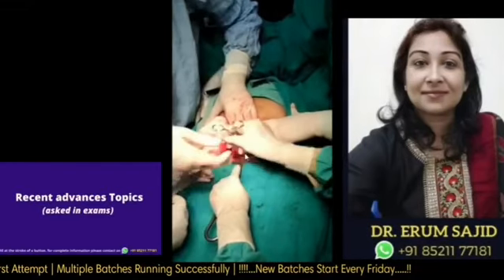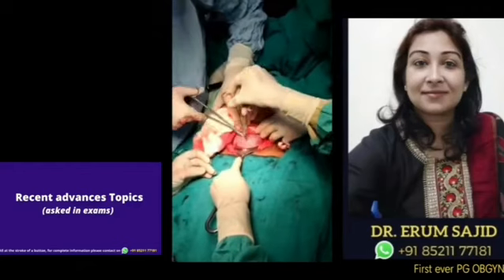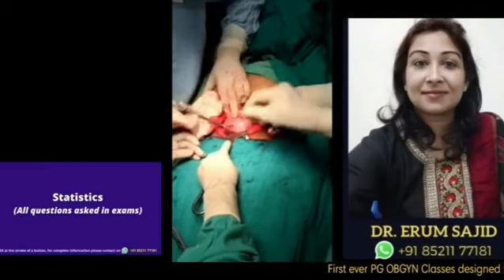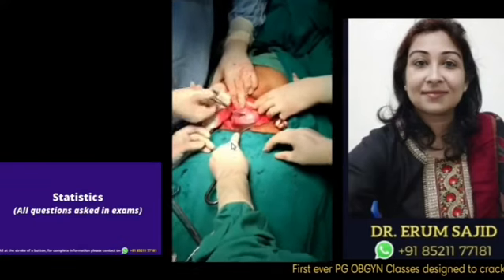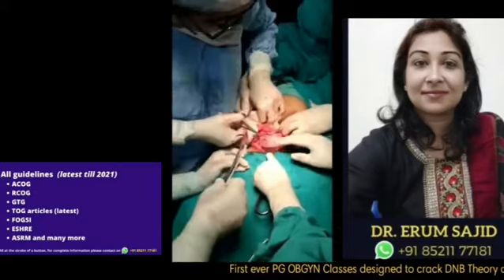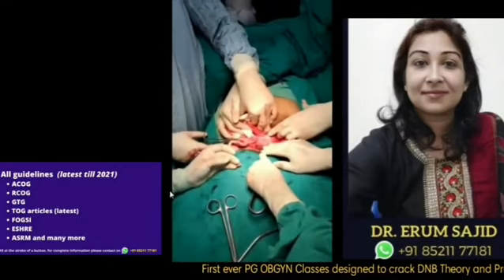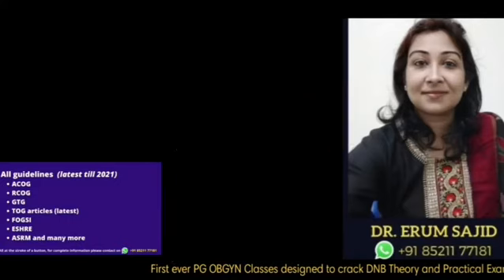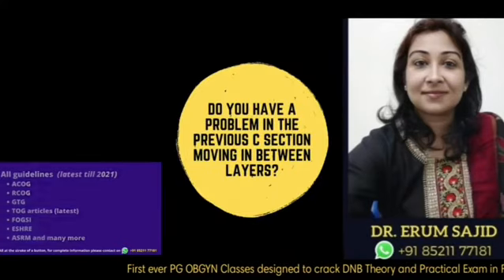I'm now not going down because I'm very scared of going too far below, because I've pulled the uterus up. I'm not happy with the UV fold. I don't think that it's a proper UV fold, and here I take the decision of not pushing the bladder down, to give the incision at that particular place. And with this I finish the first part.